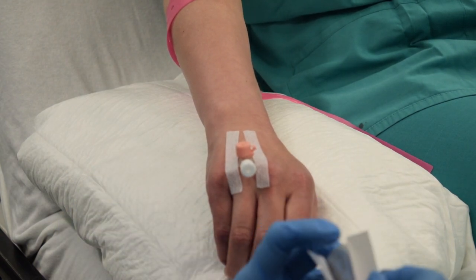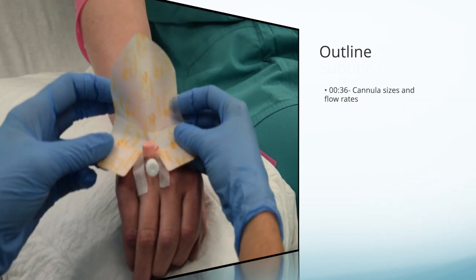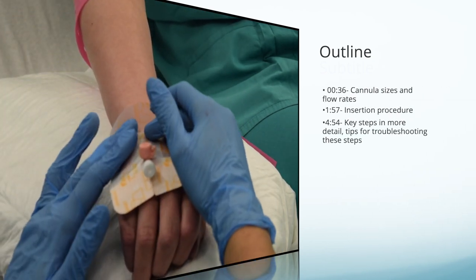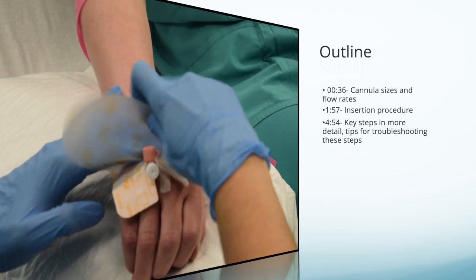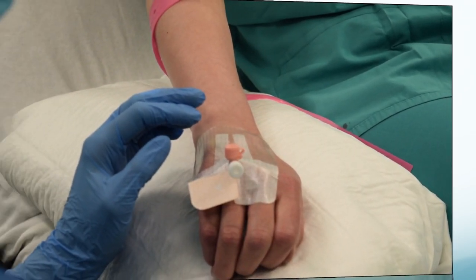Intravenous cannulation is one of the most important skills for junior doctors to perform. In this video we are going to show you different sizes of cannulas and how this relates to flow, do a real-time demonstration, a step-by-step walkthrough, and show you how to troubleshoot intravenous cannulation when it doesn't go quite right the first time.